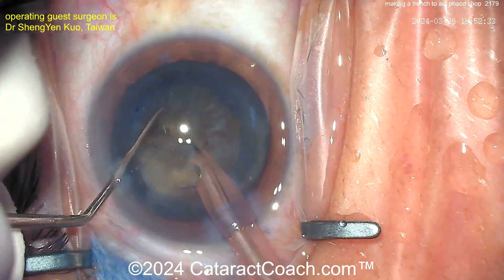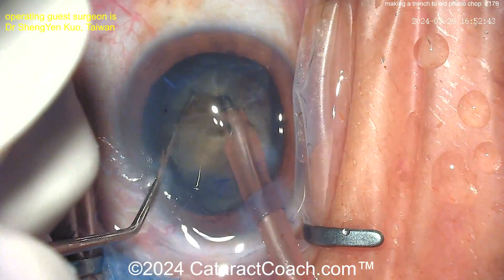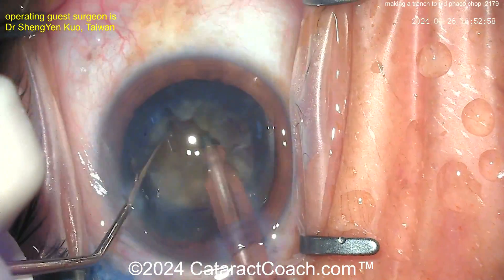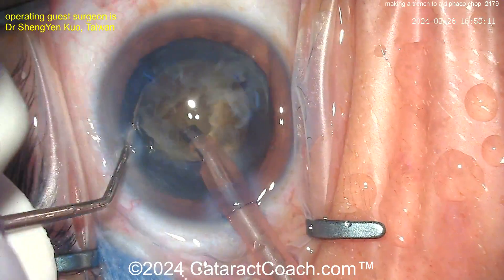It's going to be in a petaloid fashion — like petals of a flower, all kind of attached at the center. That's okay; we already know the answer: chop, chop, and more chop. Be patient — burying the phaco tip in there or making a little bit more of a groove as needed, really trying to get these pieces separated.